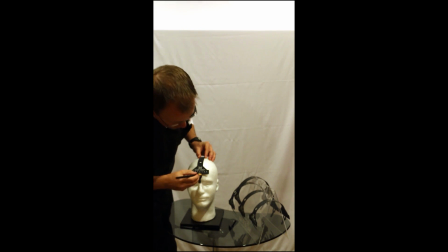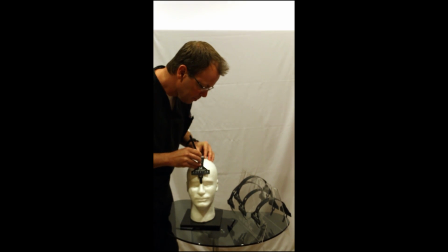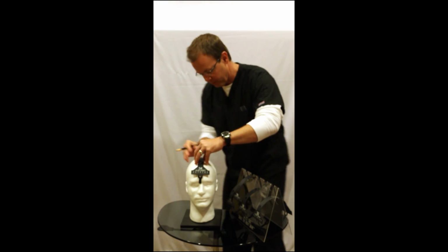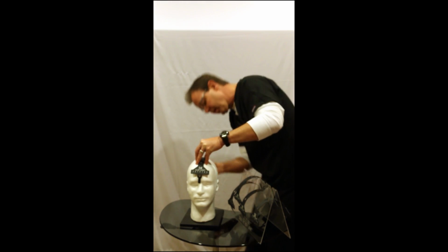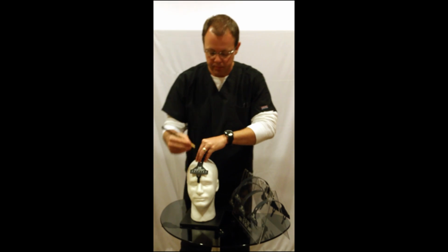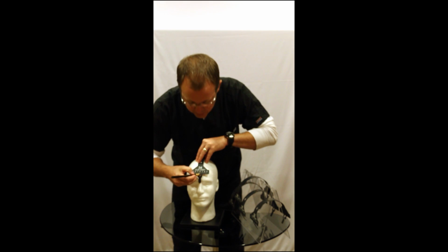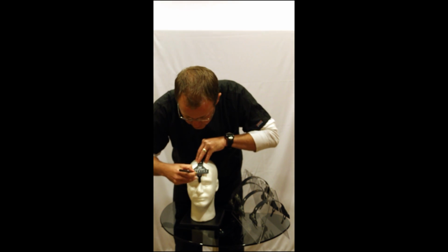choose my tool, mark 10%. At 54 centimeters, 10% is 5.4. Half of that's 2.7. 1, 2, 5.7.